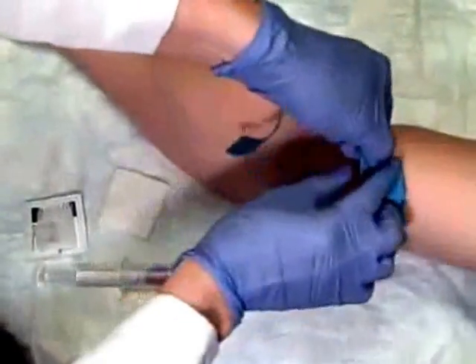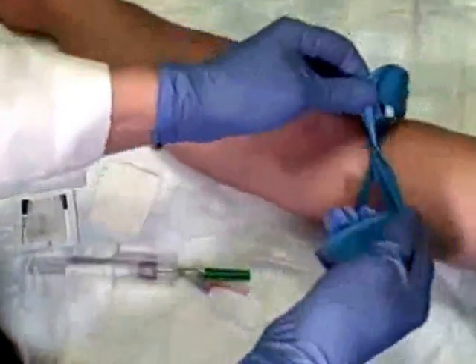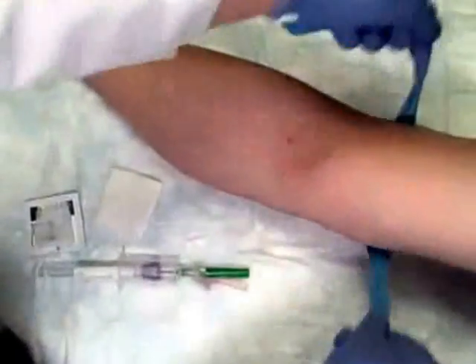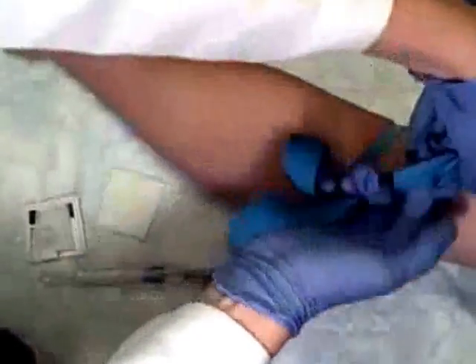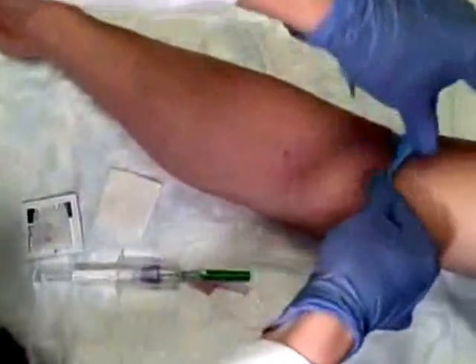I'm going to apply my tourniquet, and I want to make sure that I can get it off quickly. Instead of tying a knot, I'm going to cross it and just tuck a little corner underneath, so that when I'm done I can pull this off very quickly.